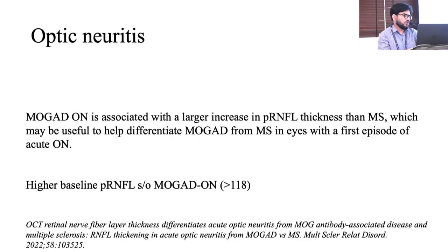So even MOG associated demyelinating optic neuropathy can be differentiated. One of the studies mentioned that if you have a higher baseline peripapillary RNFL thickness of more than 118 micron, it is most likely a MOG associated demyelinating optic neuropathy.